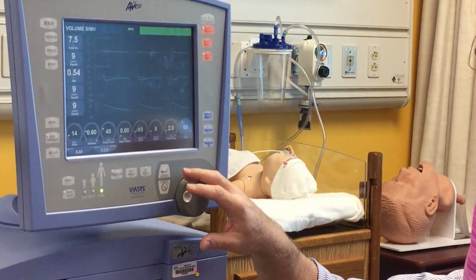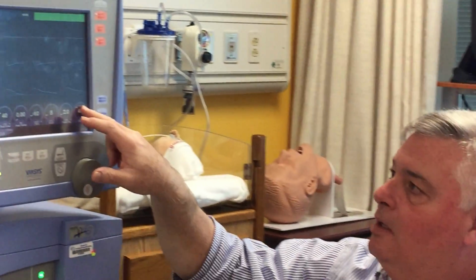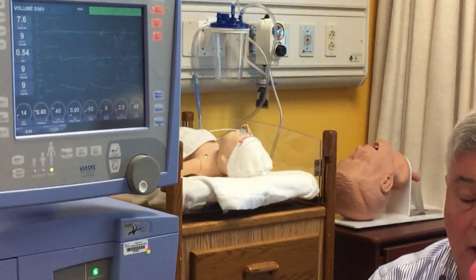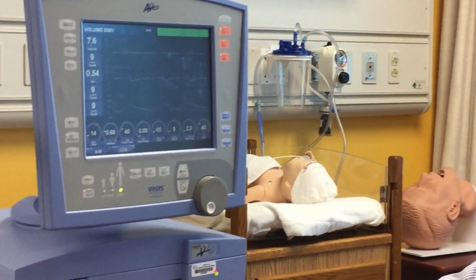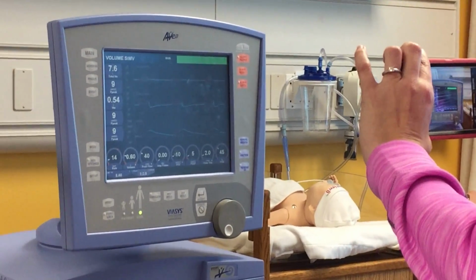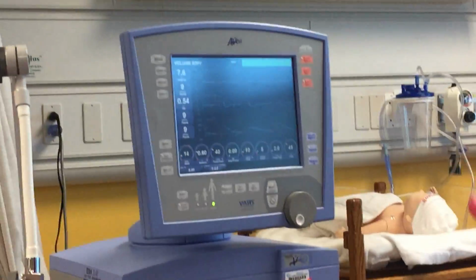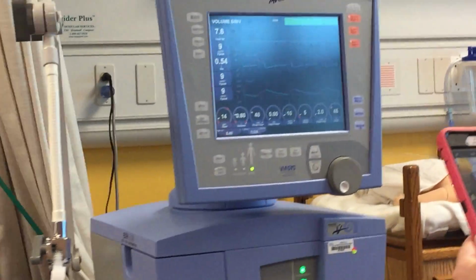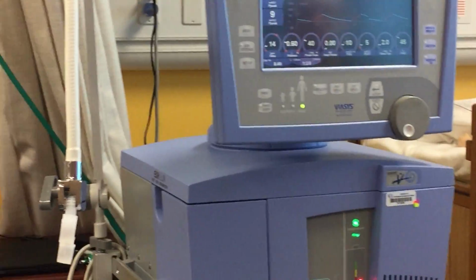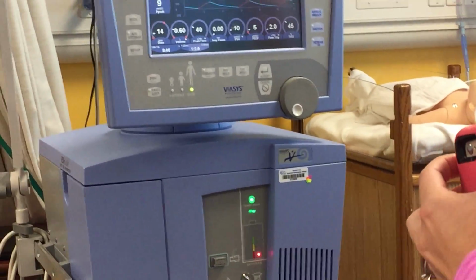Okay, so these are our basic settings for a patient in volume SIMV. So remember, volume is volume constant, right? Pressure variable. So these peak pressures will go up and down depending on the compliance and resistance of the patient's airways. Okay. So let's let this cycle for about a minute, and let's go in and let's set up our alarms.